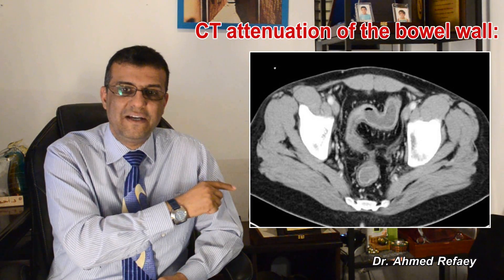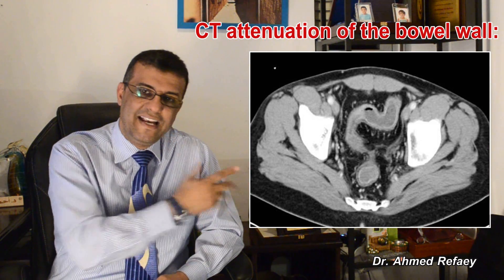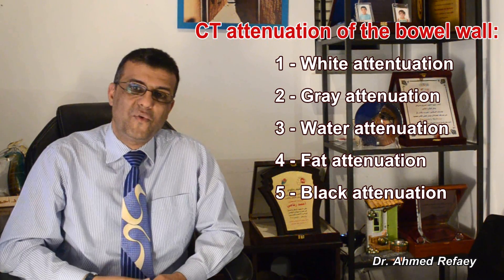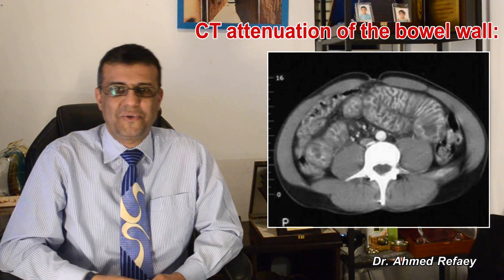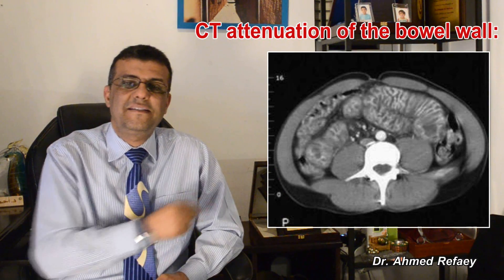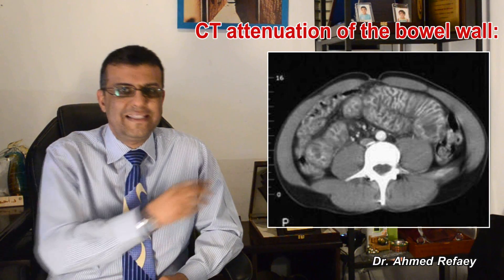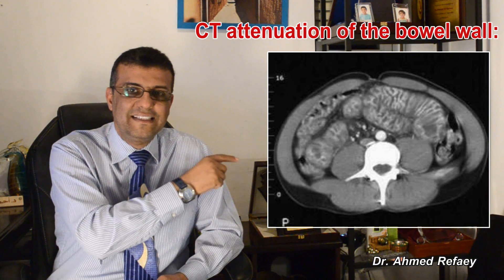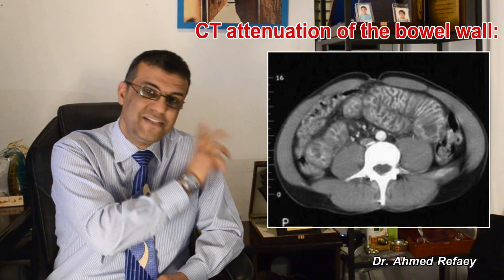Another example of white attenuation is a case of shock bowel syndrome. As you see, there is enhancement of the small intestine demonstrating increased enhancement which is greater than that of the inferior vena cava.